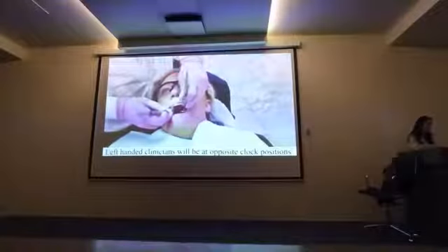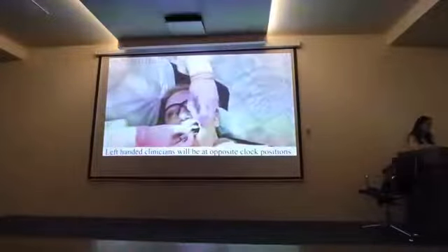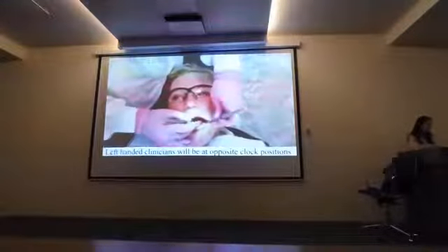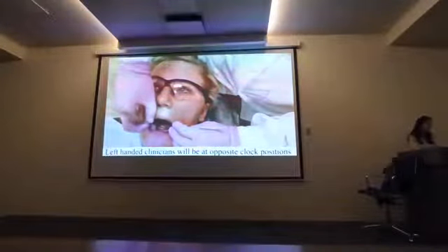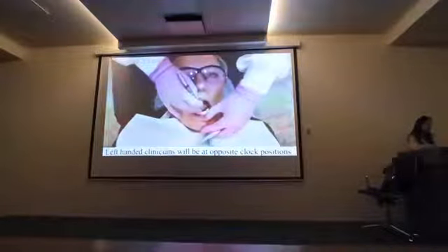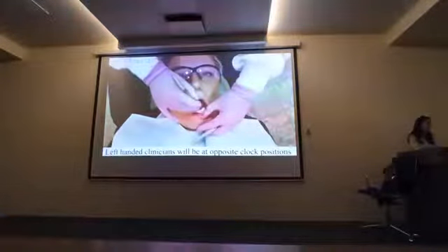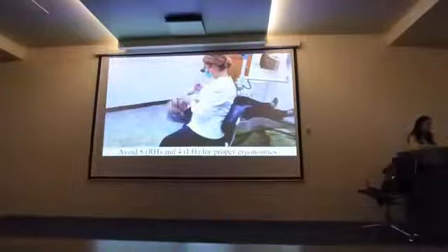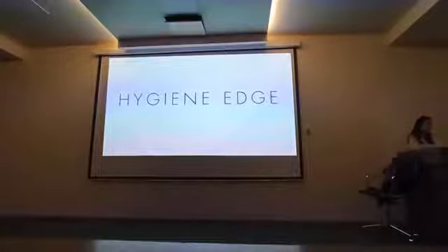For all surfaces away, clock positions vary. For the posteriors of quad 1 linguals and 2 and 3 buccal, you'll sit from 10 to 11. For quad 4 linguals, you can sit from 11 to 1. For anterior surfaces away, you can sit from 11 to 1, depending on where you have the patient's head tilted. One position that you want to limit for ergonomic purposes is 8 o'clock, or 4 o'clock for the left-handed clinician, as it causes you to twist your torso beyond the recommended range.